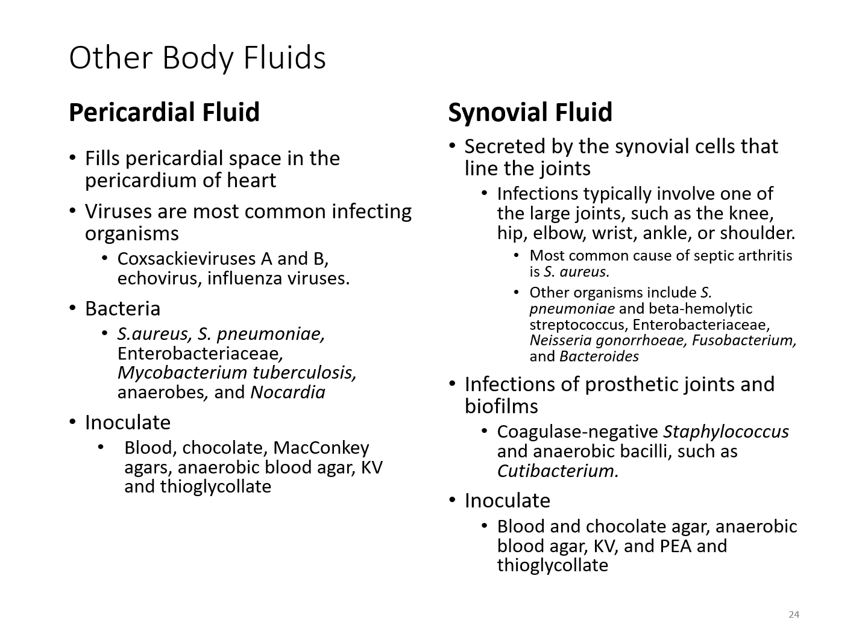Pericardial fluid, of course, this is the fluid that surrounds the heart. You can have infections from viruses as well as bacteria, and of course the media here is listed to inoculate it on. Synovial fluid, this is going to be the fluid that lines the joints.